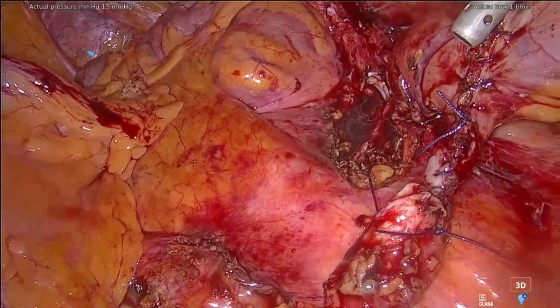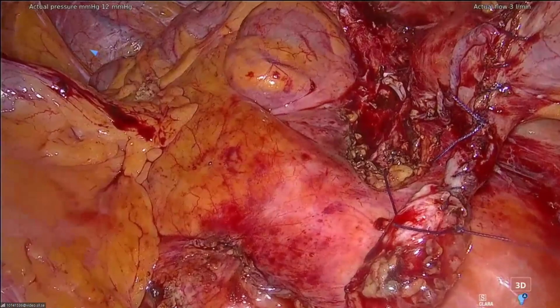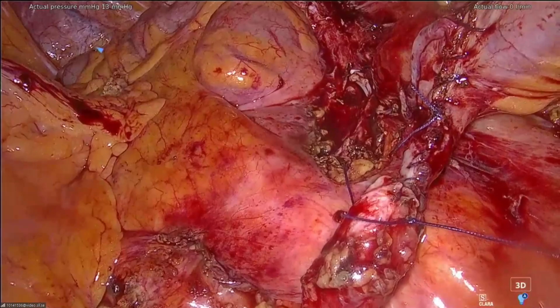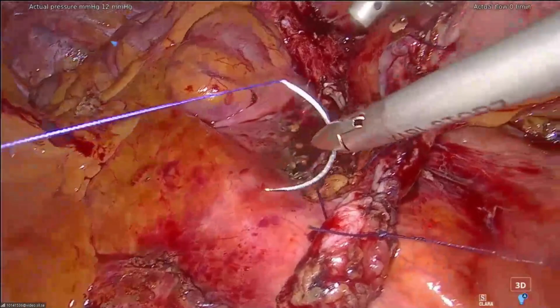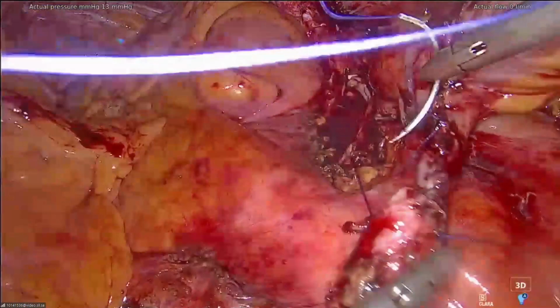You don't want to have any ischemia. Yes. Okay. So I have the risk that a big piece of tissue will finish obstructed. But I just want to put one stitch there. Okay. Just one. Just for self-satisfaction. You see, Renaud, I'm a good friend. So now you can sleep well after this stitch.